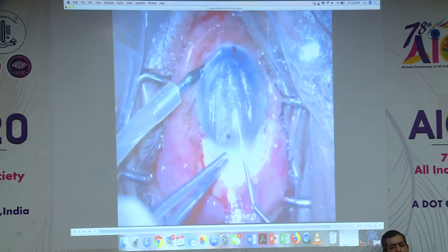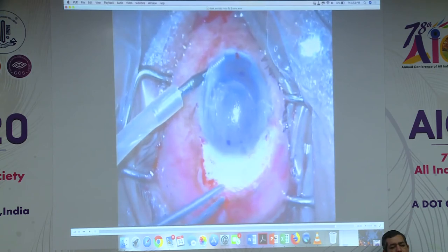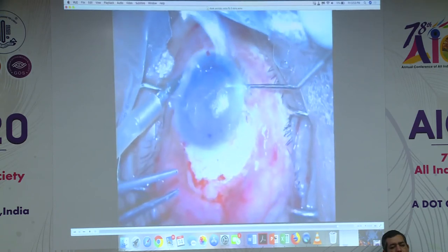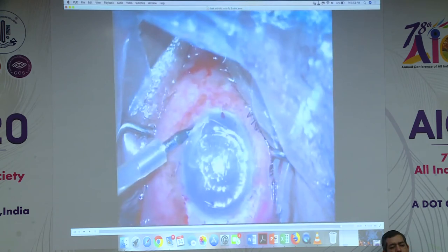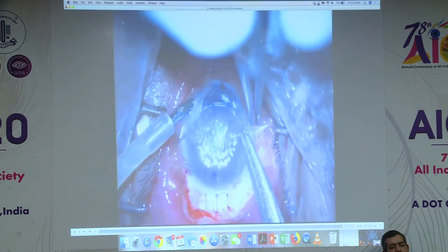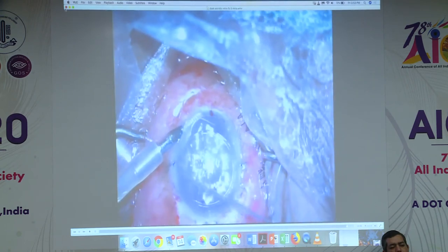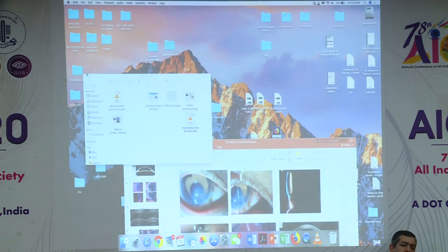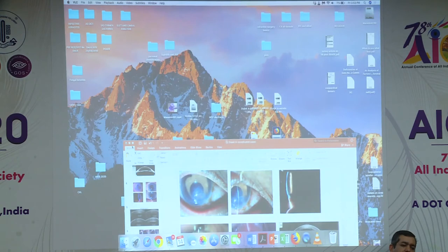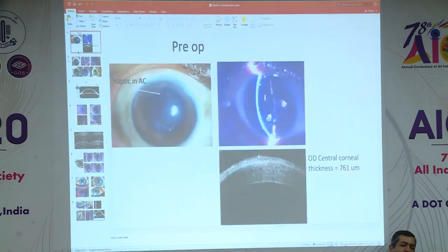This is the case again. Since this technique works best in my hands, I have not even tried to change it. I usually use a 7.5 to 8 millimeter donor lenticule and push it through the lens glide. And it has worked very well, so I do not have any extra rebubbling rates or anything like that. And this is what I will show you, the post-op of these cases. This is the case which I showed you.